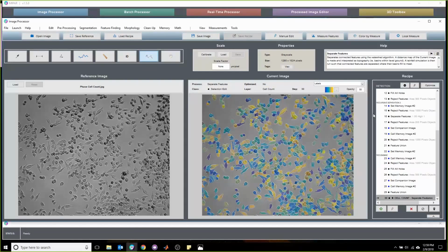So deconvolution is a technique that's used to separate, oftentimes, histological staining of tissues, to separate the image based on the stain itself versus separating the image based on the red, blue, and green channels. A classic example is H&E staining, where what you want to do is separate your hematoxylin from your eosin.